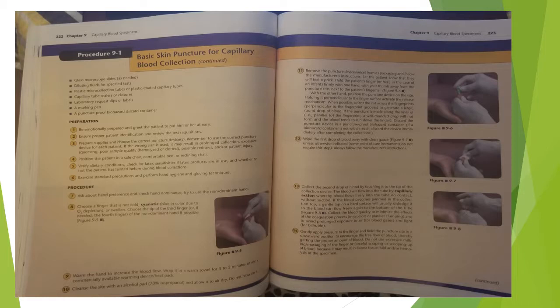Wipe the first drop of blood away with a clean gauze, unless otherwise indicated. Some point-of-care instruments do not require this step. Always follow the manufacturer's instructions. Collect the second drop of blood by touching it to the tip of the collection device.